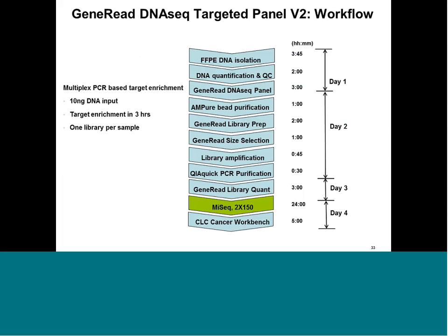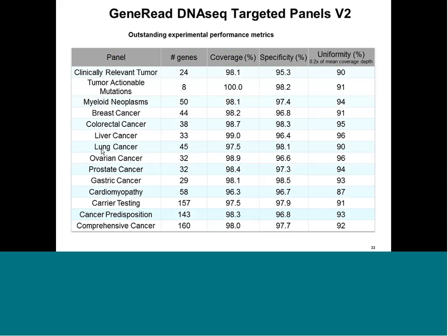And here I've shown you the workflow from FFPE slides, extracting DNA, generating small libraries, adding molecular identifiers and sequencing primers, and then going on a next generation sequencing platform and sequencing with high coverage and high sensitivity. And such panels are now available for many tumor applications, so you don't have to dig in these public libraries and search for informative genes. There are commercially available gene sets adapted to breast cancer, to colorectal cancer, to lung cancer, and so forth.